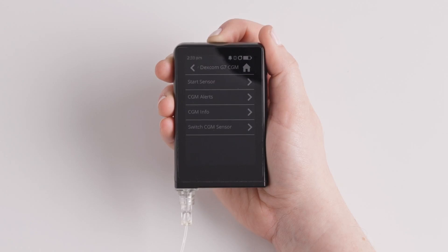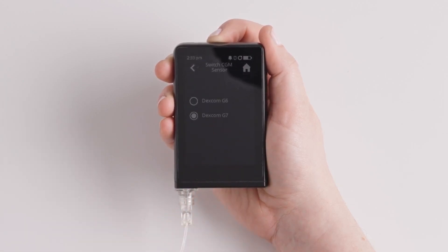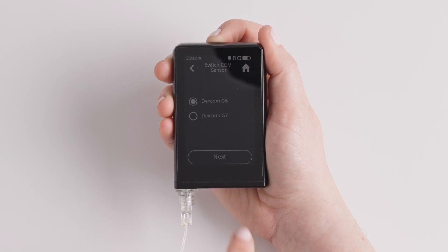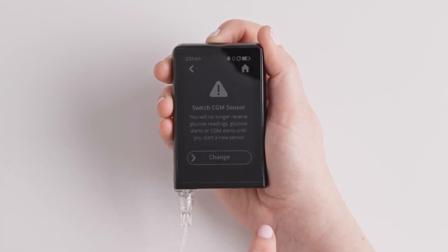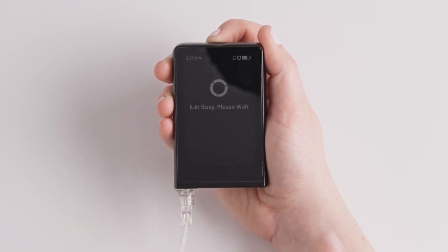Tap Switch CGM Sensor at the bottom of the list. Select the sensor type you are switching to and tap Next. Drag the switch slider to the right to confirm your CGM sensor selection.